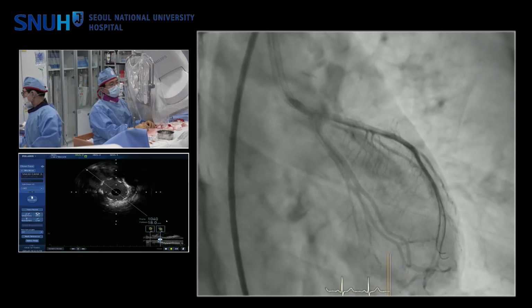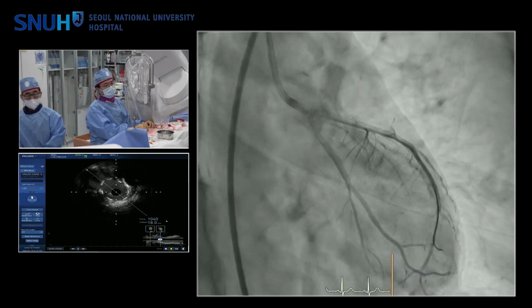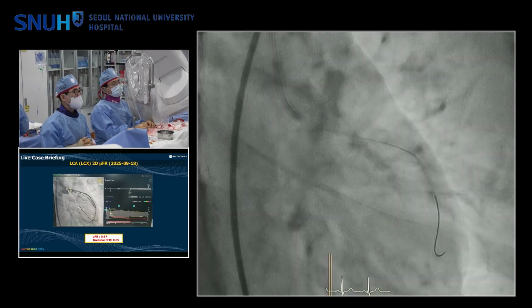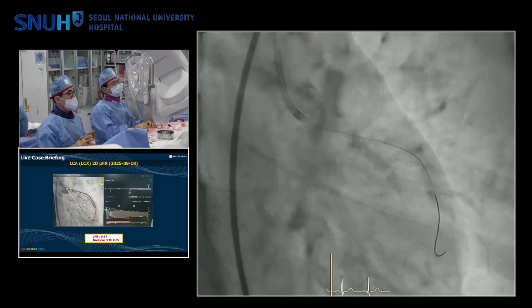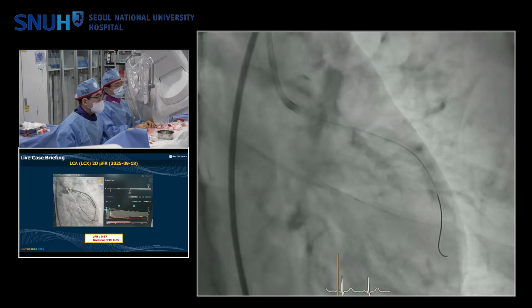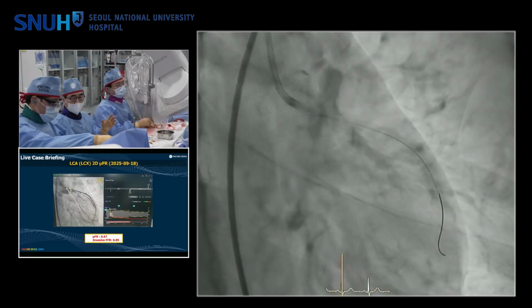아, 준비를 안 했나? The trade-off is a pinch of side branch after a high pressure inflation of main vessel. But this finding, I think, acceptable. But circ territory is wide.